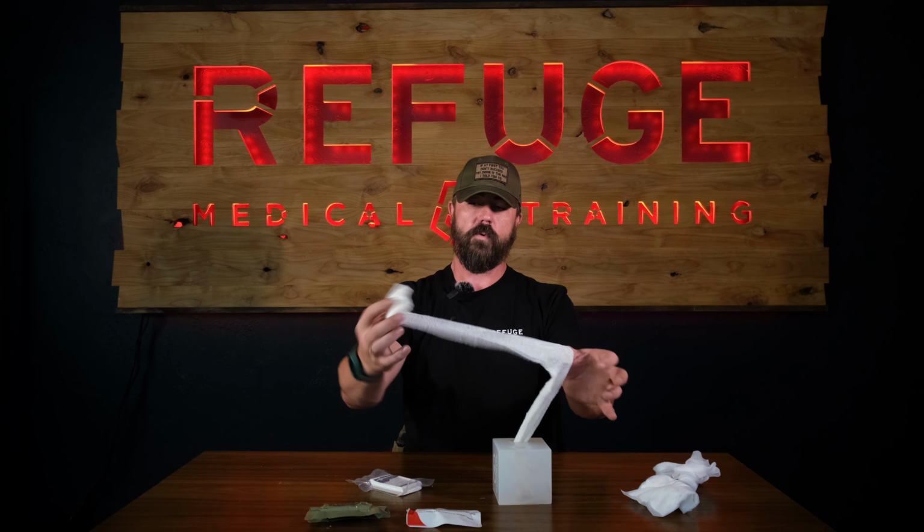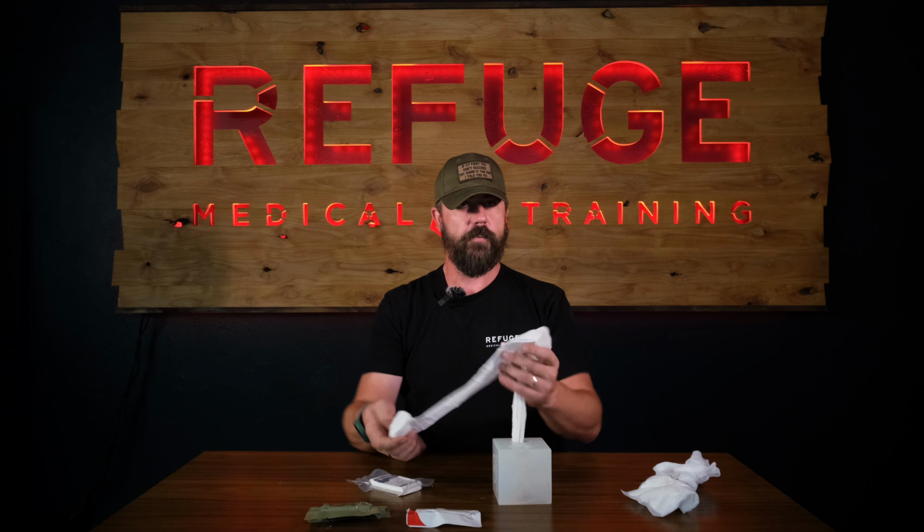But other times, maybe a larger wound like this, it's very, very efficient to be able to fill that wound quickly with a very thick gauze. And again, you see, even though it was compressed in a brick, it is a roll of gauze. Some people can have a hard time maintaining control of this roll while they're wound packing. So once I've driven that in, I'm going to maintain pressure nonstop. We have videos on wound packing, so I'm going to drive this in, keep going.